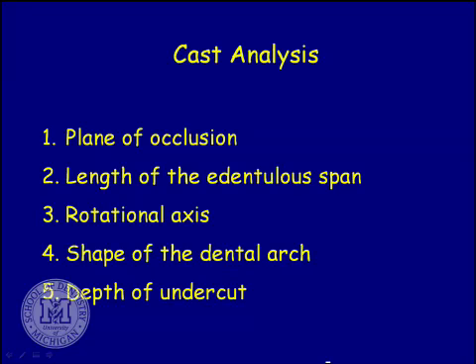How come? Because the substructure may flex a little bit. And if the substructure flexes a little bit over a long span, and the overlaying ceramic doesn't, then it's going to develop stress fractures and fall off. So length of span is sort of an issue. As spans get fairly long, they're almost easier to do a rotational path. Why?